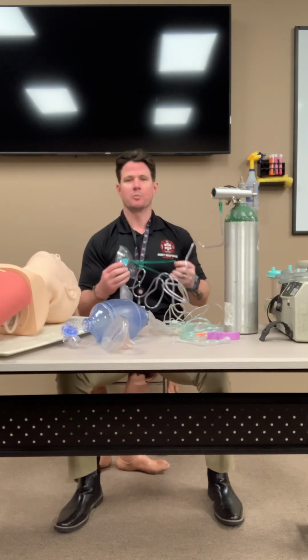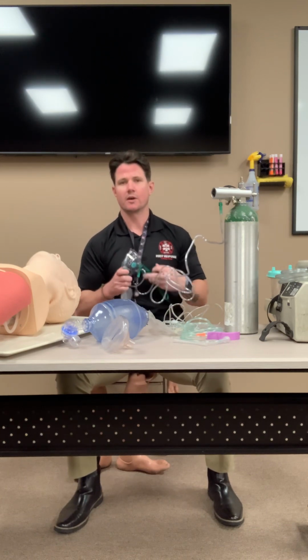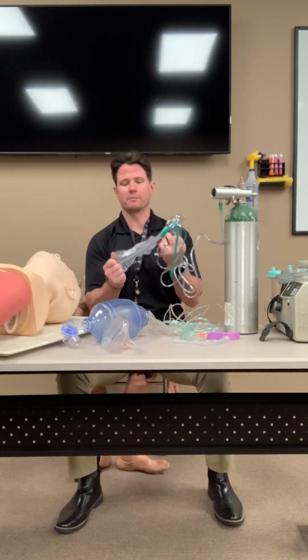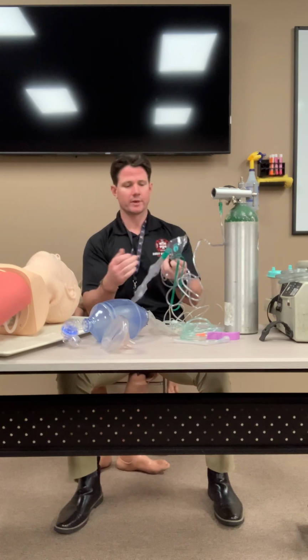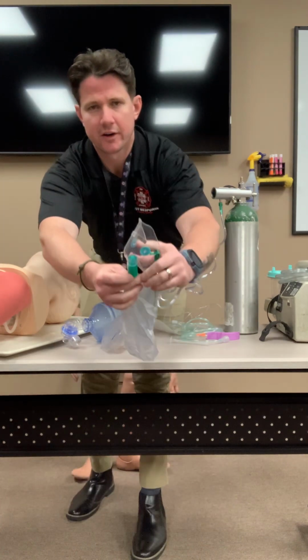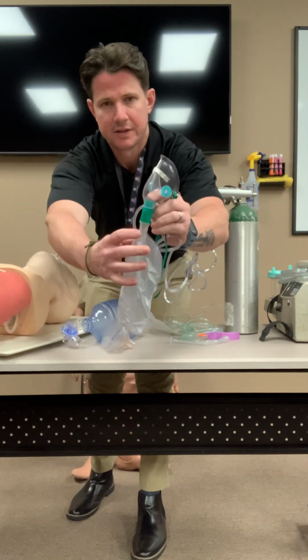As I stated, very important, right? You will be wearing PPE when doing this, okay? All of your skills, minimum of glasses and gloves, okay? You must fill the reservoir bag before putting this on the patient's face, okay? So once oxygen is flowing through it, right, you're gonna take your gloved hand and you're gonna put your finger over the reservoir bag, and this is gonna fill up.